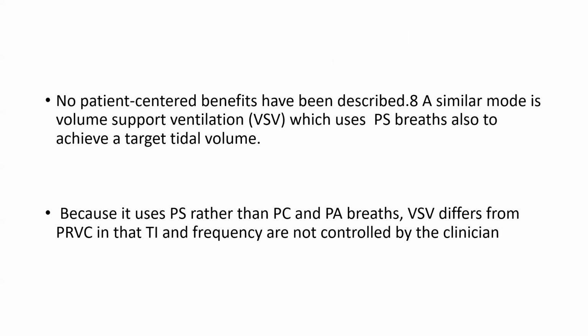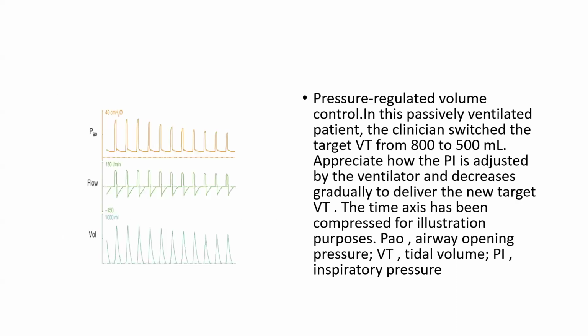A similar mode is volume support ventilation, which uses pressure support breaths also to achieve target tidal volume. Because it uses pressure support rather than pressure control and pressure assist breaths, volume support ventilation differs from PRVC in that inspiratory time and frequency are not controlled by the clinician.